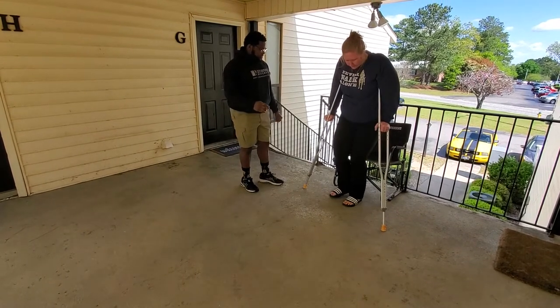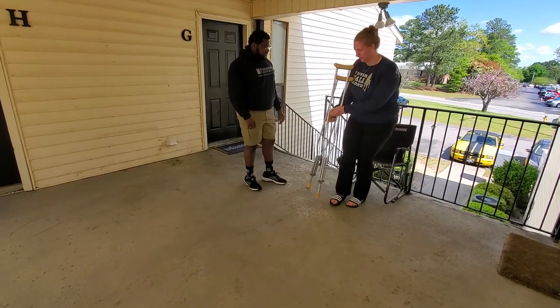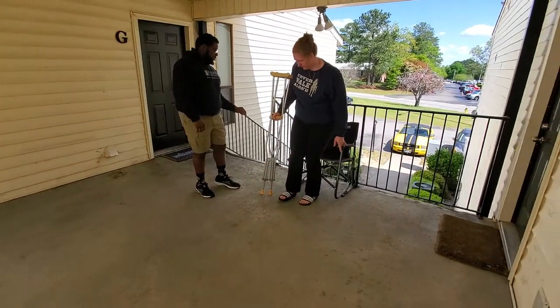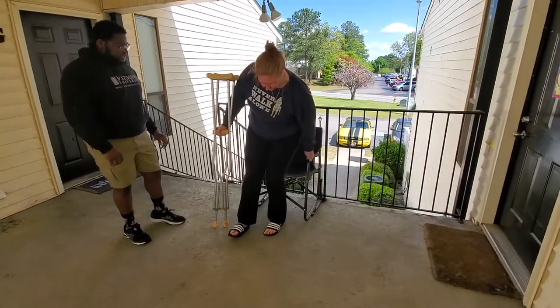The crutches go on the side of the leg you had surgery on. Before you sit back, make sure your feet are close to the chair as much as you can, and then lean back.